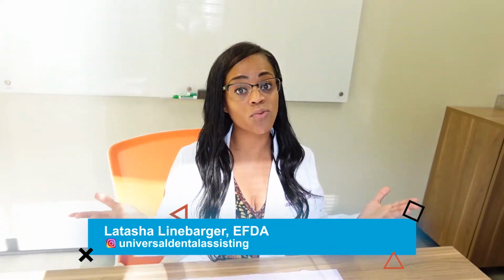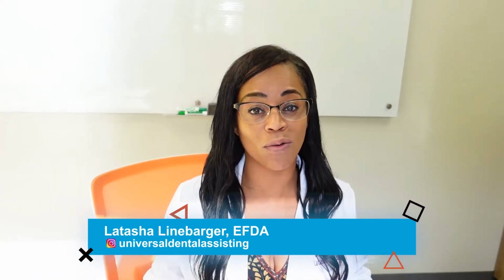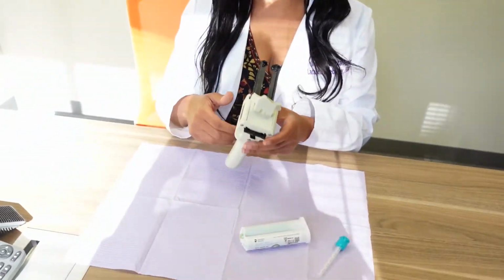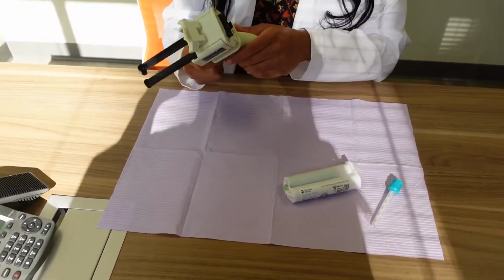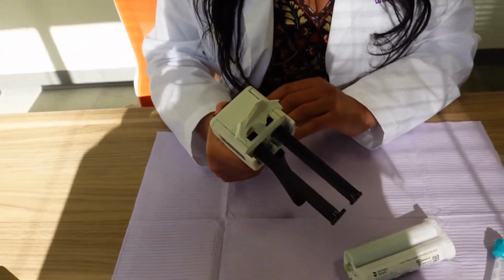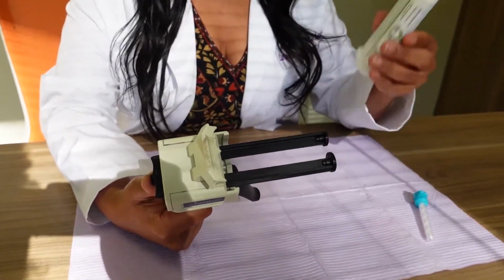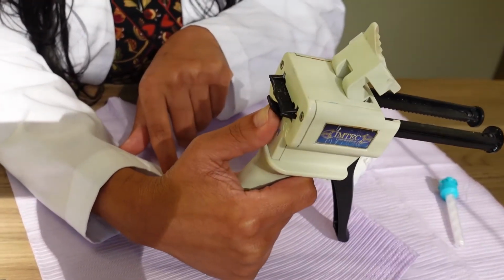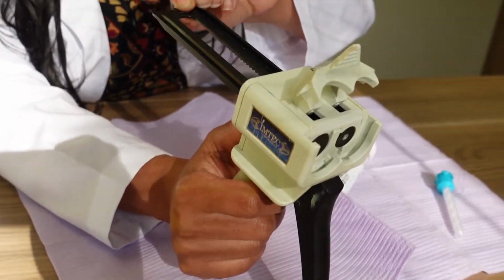This is really simple. It may seem simple, but it's not simple to a whole lot of people. For instance, this is an actual gun that we use to place material in when we're dispensing material, heavy body, light body. So for instance, this is the gun, right? Now this is protruded out, which means it's definitely not ready for this to go in. So what we do is we push this button up, and we pull it out.